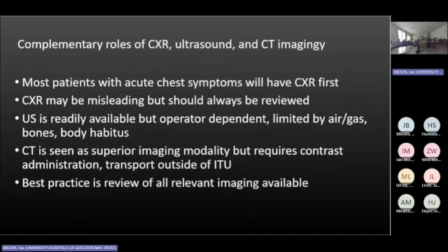Other things. From my point of view, the best practice when you're assessing imaging, trying to figure out what's going on, is to use all the imaging there is. That's why we have PACS. I know you are not sending your echocardiograms or ultrasound scans to the PACS, but you have access to X-rays and CTs, and as we do in the radiology round, we occasionally look back. There could be a CT telling us there was advanced interstitial lung disease last year, and it might change your strategy.